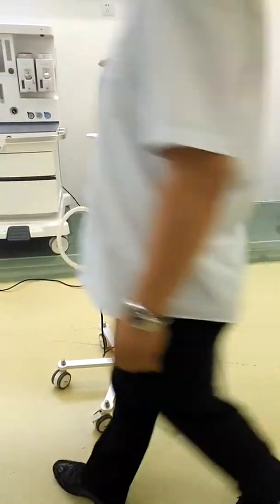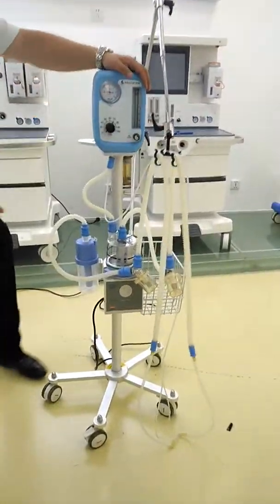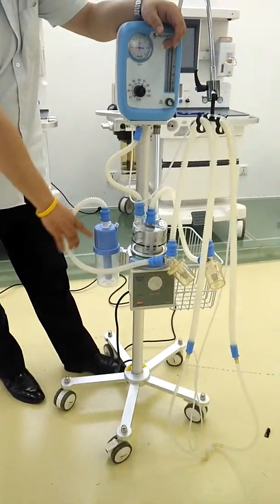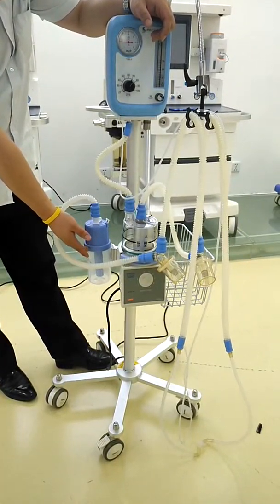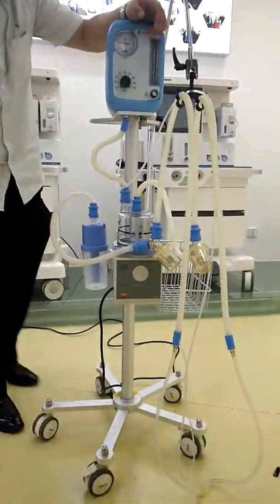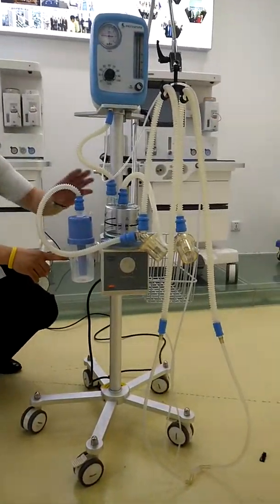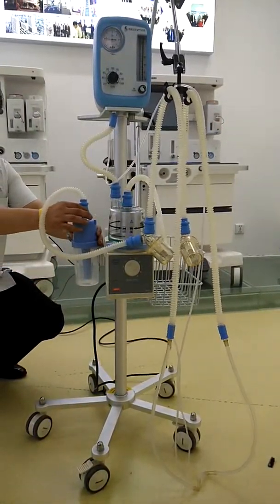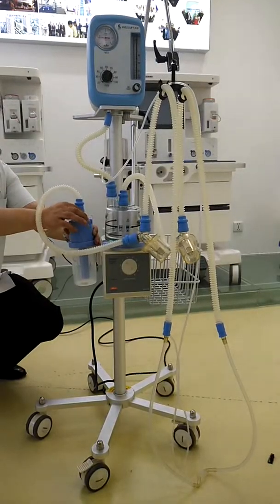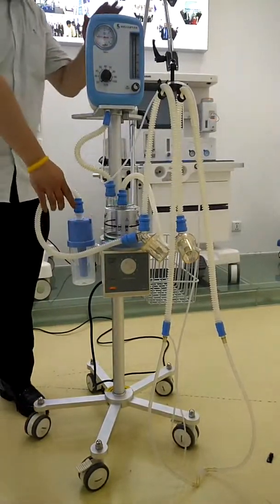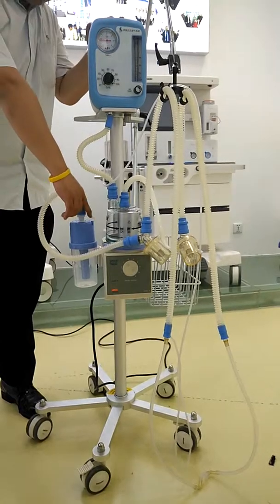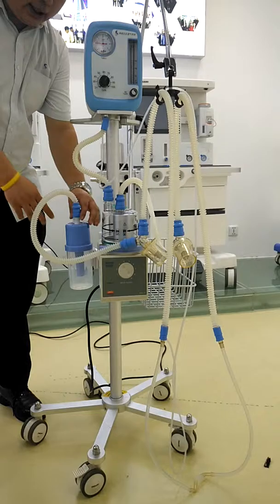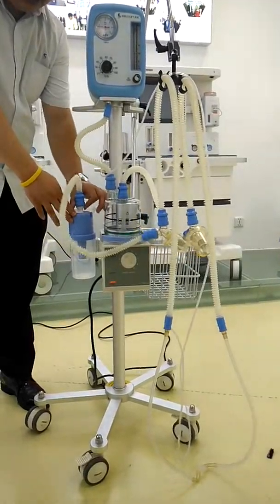For the principle of this machine, as we call it a bubble CPAP, this part is very important. This one is for adjusting the pressure using a water column. Inside you can put water in, and you can see there is a line. The water should not be above this line. With this white item we can adjust the pressure from 1 to 10 centimeters water pressure.